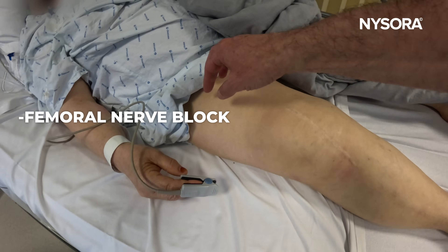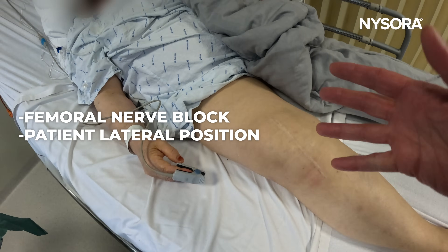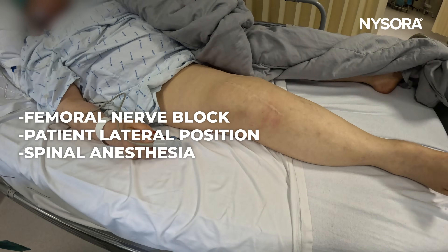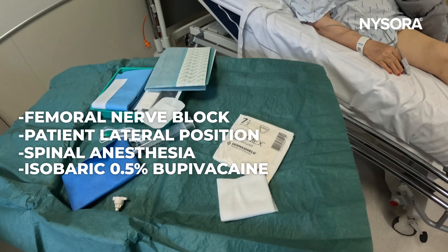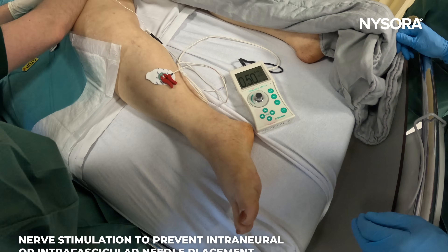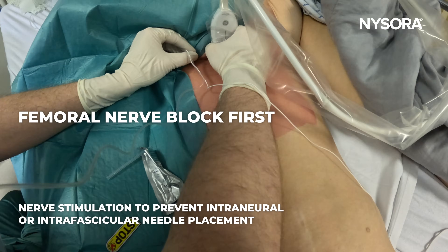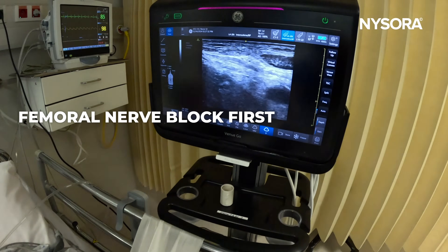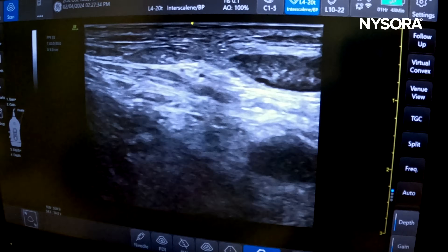So we're going to do a femoral nerve block single shot, place the patient in the lateral position, and a single injection spinal anesthetic is all that is needed. There we go — the femoral nerve block goes in. I can see nice anatomy of the femoral nerve there.